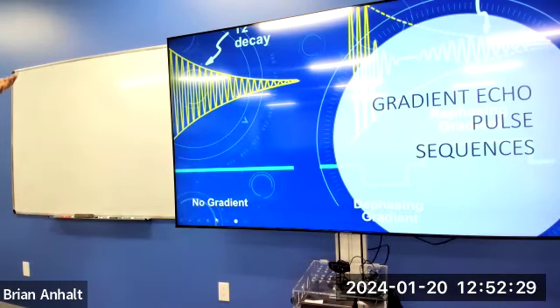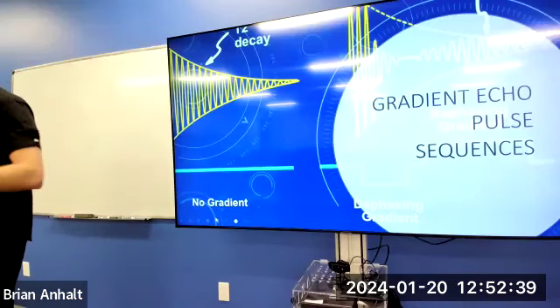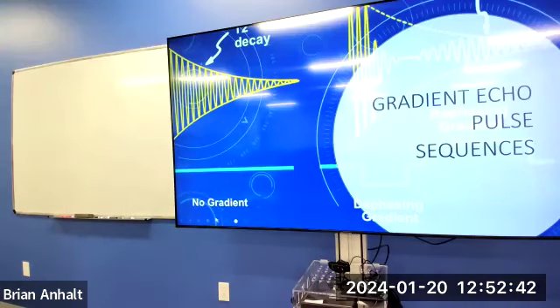That was the spin echo family of sequences. In MRI, there are two families: spin echo and gradient echo. And there are tons of different variations of these gradient echo and spin echo sequences. We're showing you the very basic kinds right now. What differs them is refocusing.